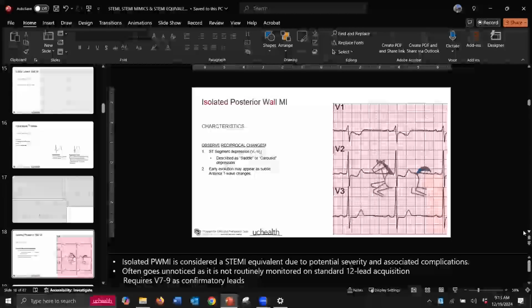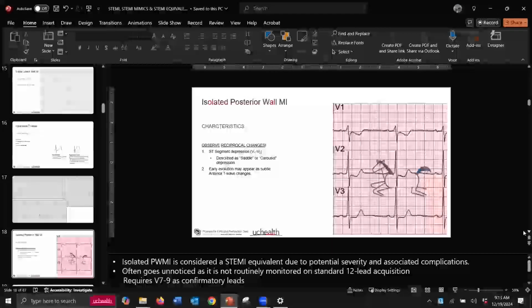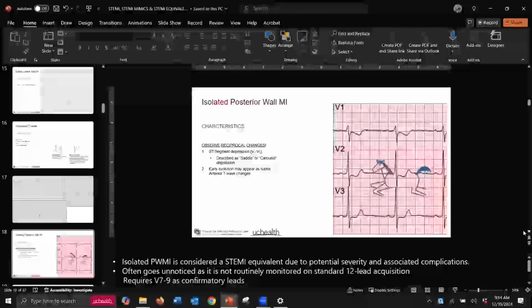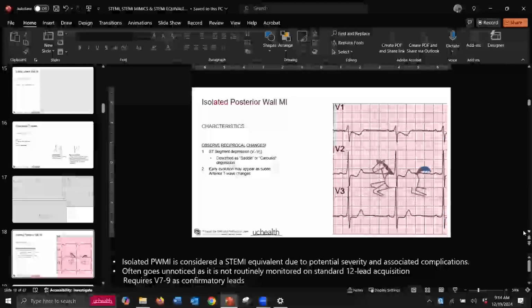And it's not necessarily necessary to move all 6, just move 3 of them. But you have to also label your leads. Yes, please. That's a good thing, so you're not like, what is this? Exactly. Doc looks at it and you're going, how the hell did this happen? Right? And you're a paramedic? Well, no, not really, but I stayed in a Holiday Inn Express last night. So makes sense?